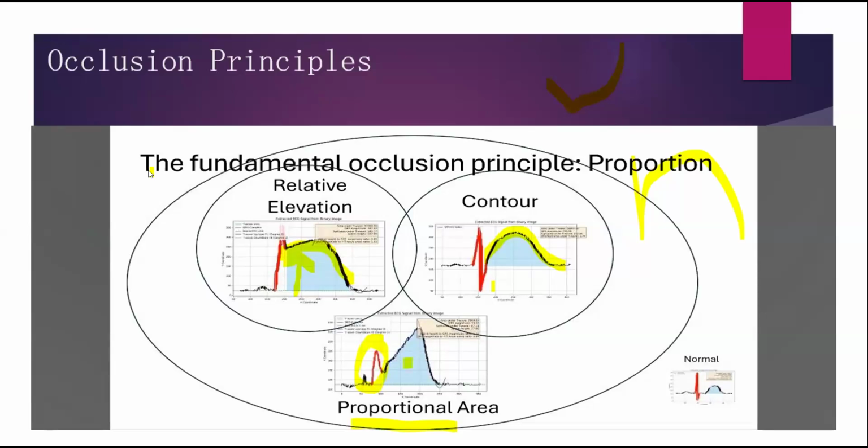Guys, kindly, these are patients that we had, so live patients. Tell me what you think of this ECG, and what is your answer, and then we'll answer live. So a 25-year-old patient with a history of palpitations.